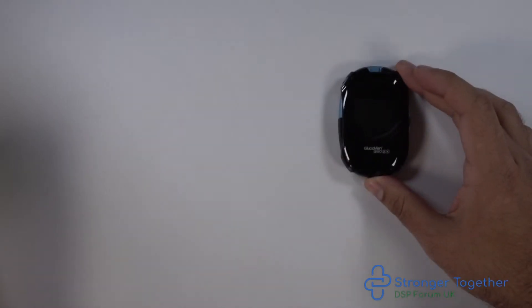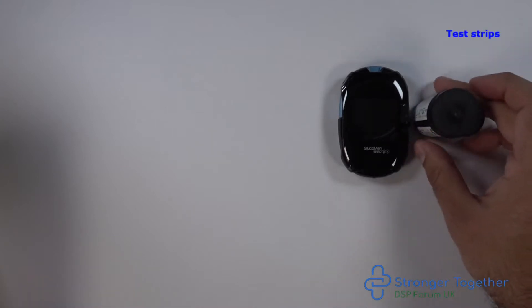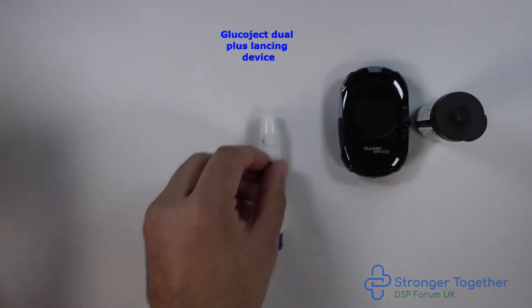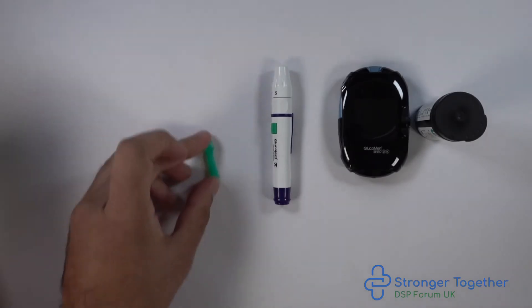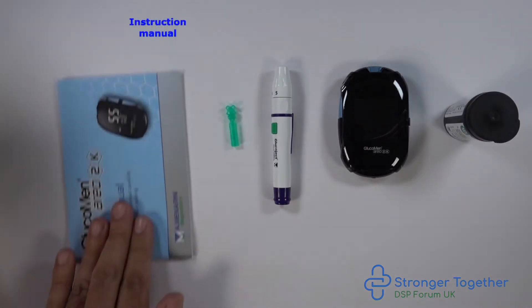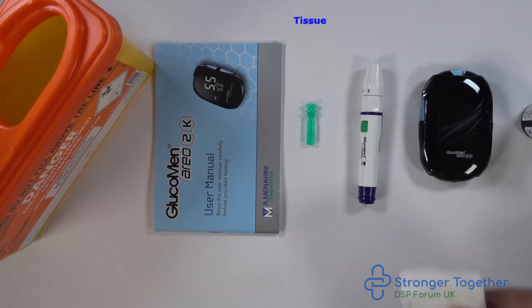We need our Glucomen REO2K machine, our test strips, our Glucoject lancing device, a lancet, our instruction manual, a sharps box, and a tissue.